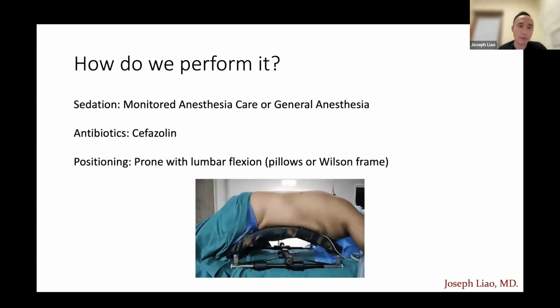So we're going to talk about how to perform this case. This is performed under monitored anesthetic care or general anesthesia. We routinely give antibiotics because you are implanting a device and making an incision. The most important part of this procedure is to make sure you have a good patient position to optimize lumbar flexion. The better you're able to flex the lumbar spine, the easier it is to place the device because you will open up that space, just like we would do for a spinal cord stimulator.